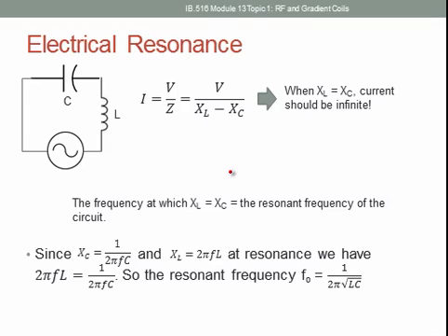So this is very important, this idea of impedance, because for the RF coil, we need to get to a situation where we have resonance. If we go back several modules ago, we talked about resonance. So in order to efficiently flip our magnetization vector from the z-axis to the transverse plane, we need the B1 field to be set to resonance. So how do we do that in our coil?